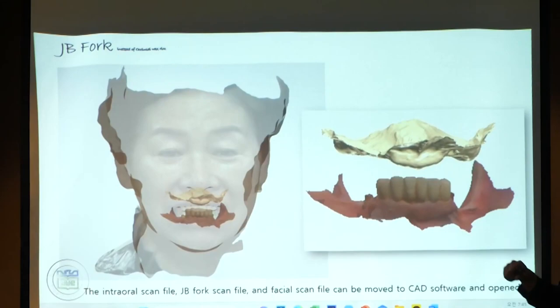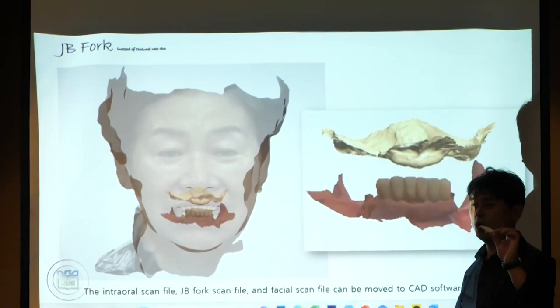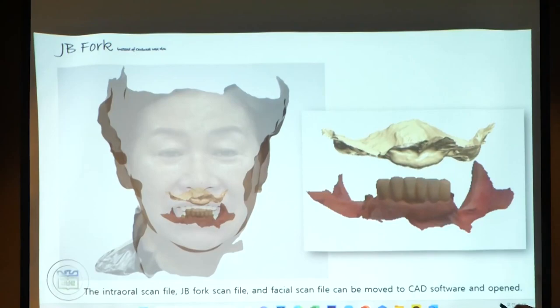Anyway, in the lab, they will open every piece of information in the CAD software, exocad or 3Shape, everything. So this device is for the clinical procedure, not a specific tool for specific CAD software, you know? You can use everything. You can use it in the conventional denture procedure. Yeah, I will show you. Anyway, I skip, and then the design is complete, and then they make the temporary denture.